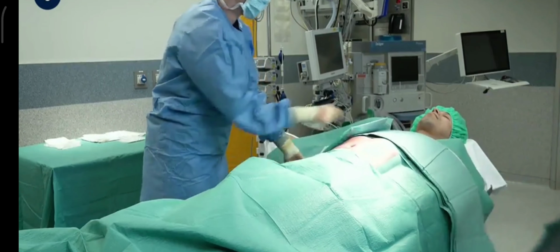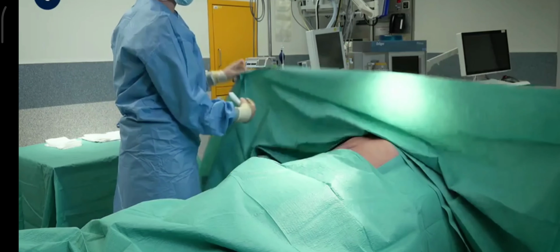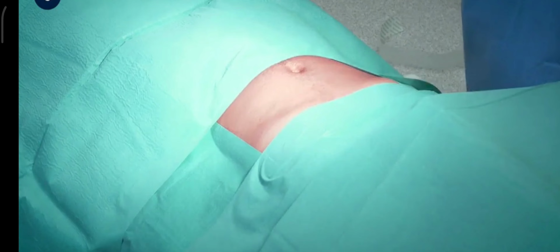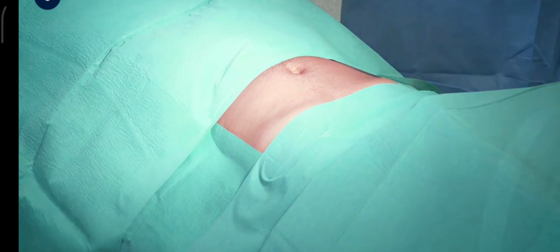Take note that typically this larger drape will be placed over an anesthetic stand surgical table accessory. This was not done in this film to allow maximum visibility. Square draping of the abdomen is now complete.